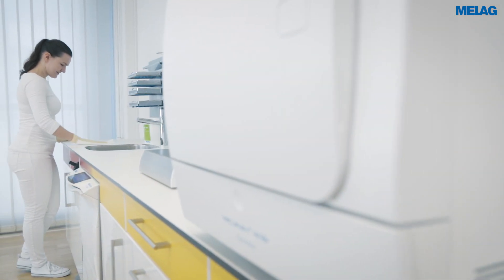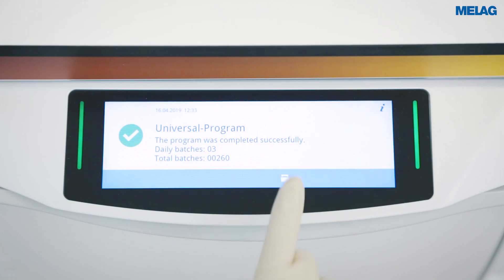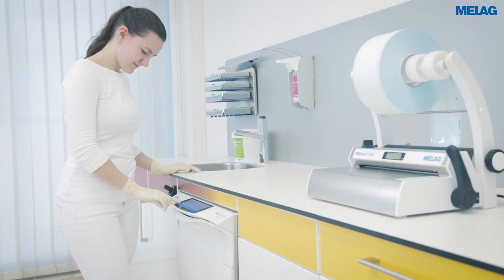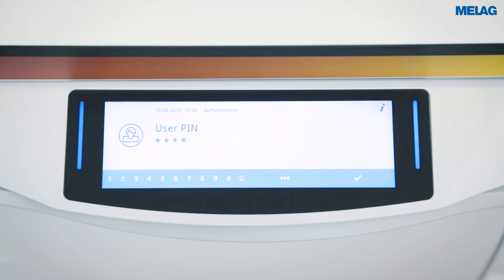The smart touch display of the MELAtherm 10 Evolution ensures a quick and paperless approval process. After completion of a program, please enter your PIN for user authentication. You can then open the door.